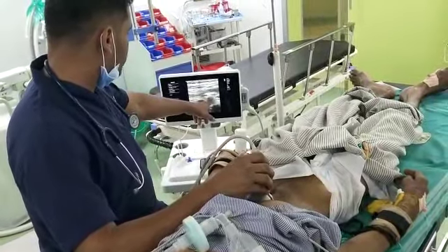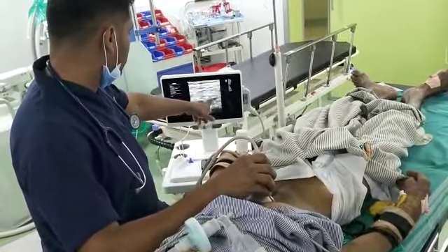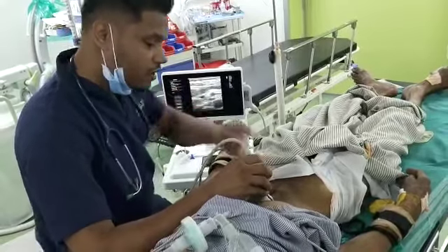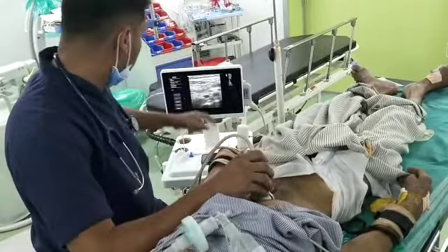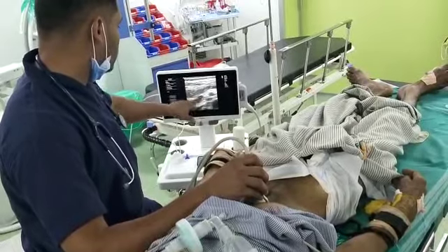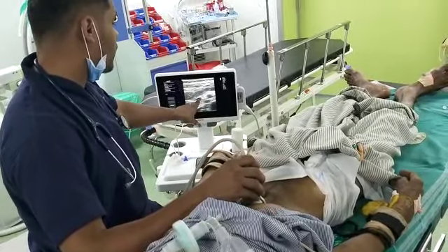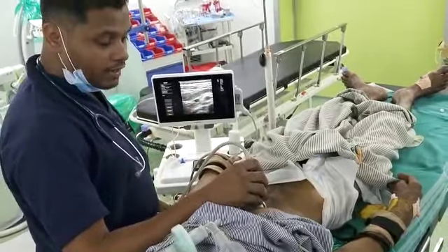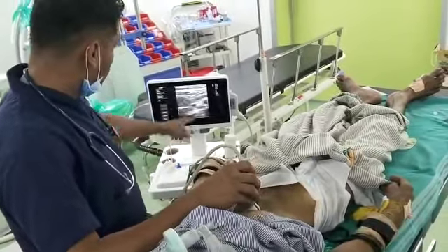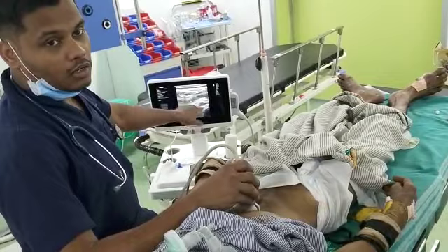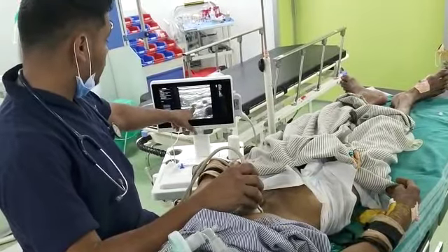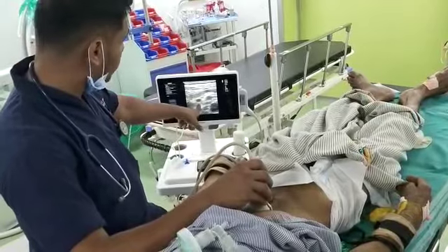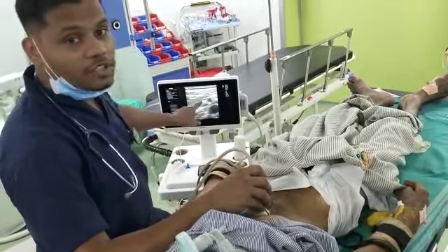This is the aorta, which is pulsatile. P is the right side, and my marker is also on the right side. So this is the aorta, and to the right of the aorta is the IVC. We can identify the IVC because it is to the right of the aorta, it is easily compressible, and once you compress this vessel, the IVC takes a tear shape.